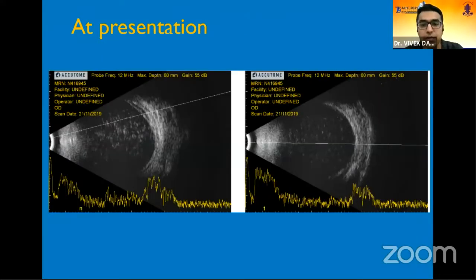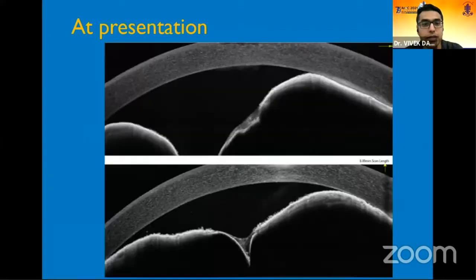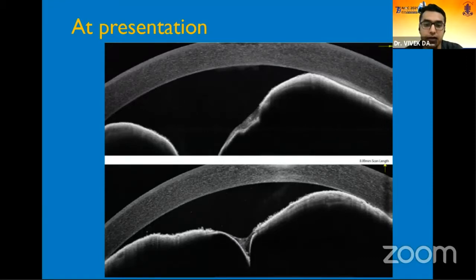This is what the B-scan looked like — emulsified old oil in situ. The anterior segment OCT beautifully delineates how at multiple areas the iris cyst was adherent to the corneal endothelium, and the anterior chamber had subsequently become very shallow.